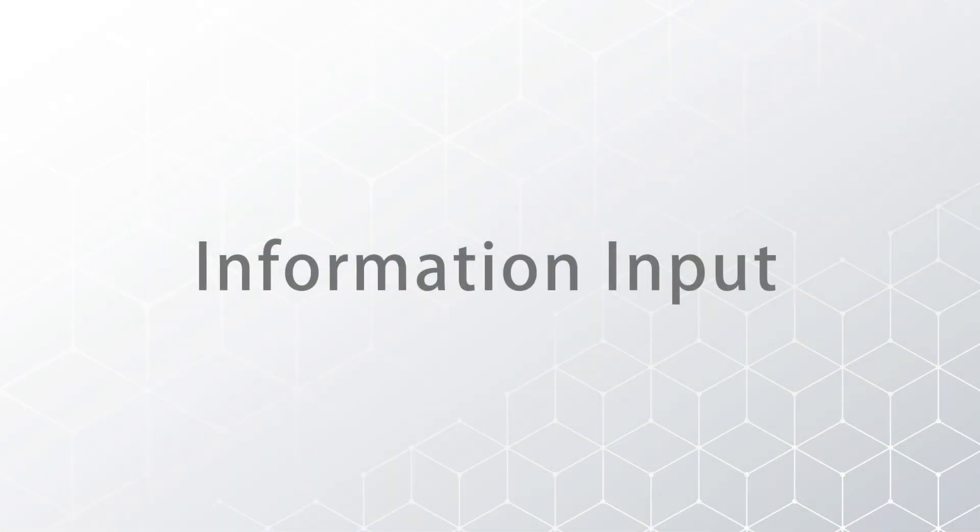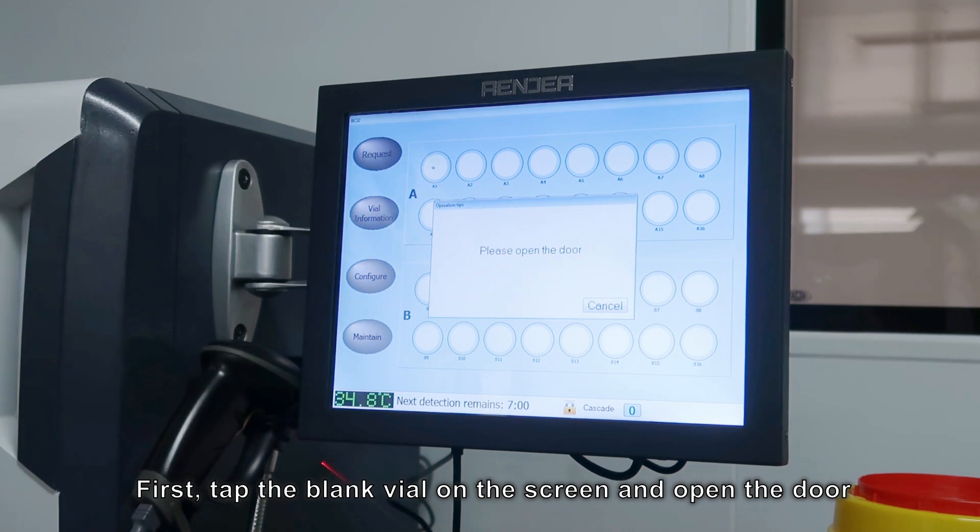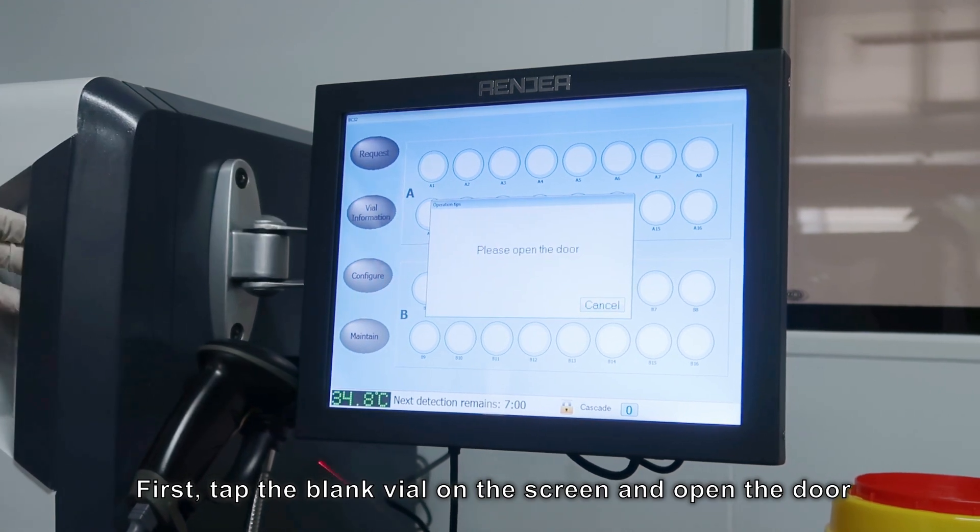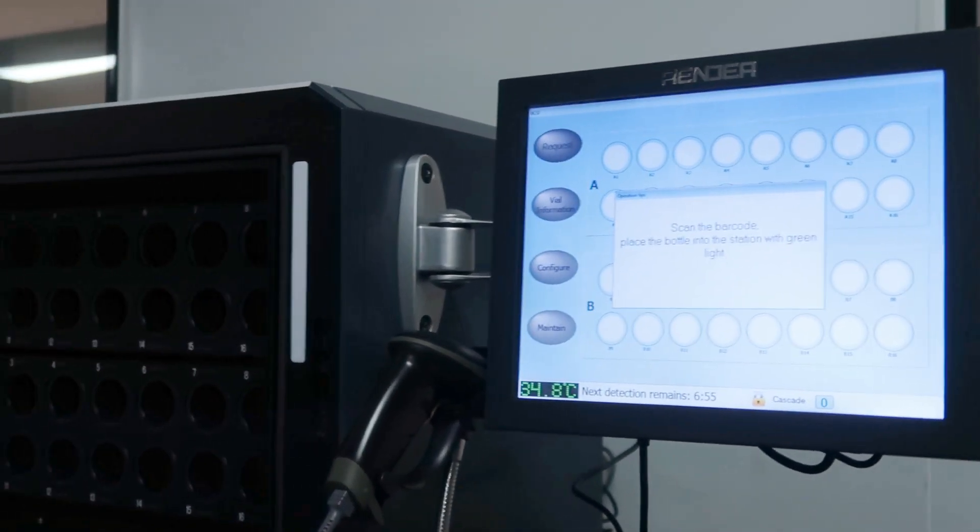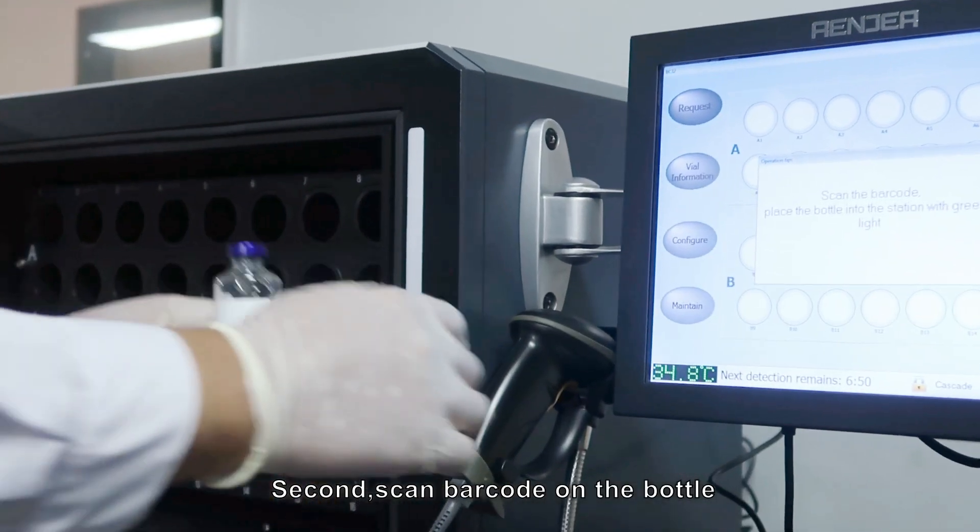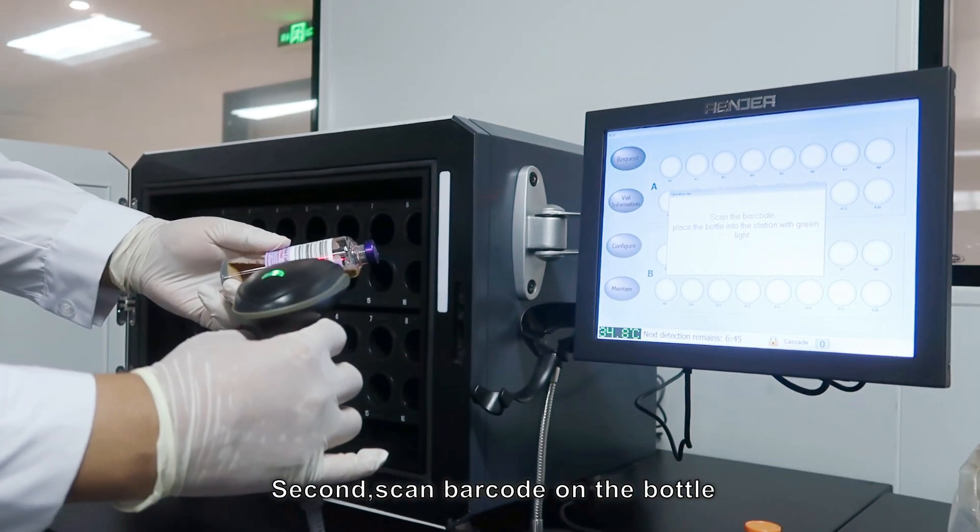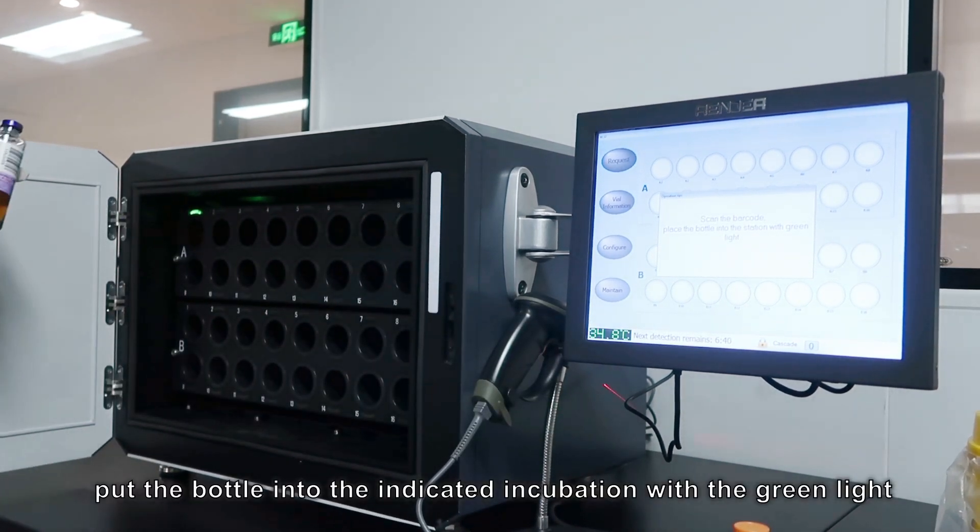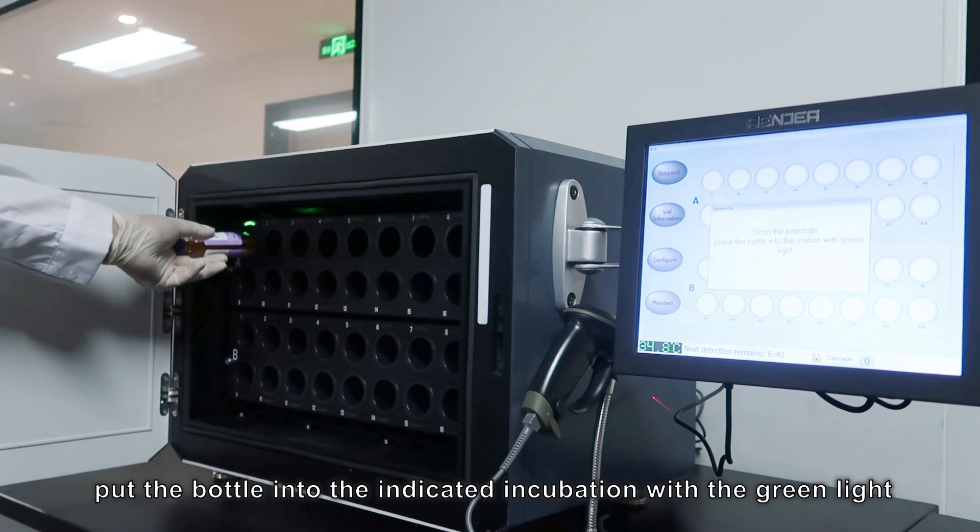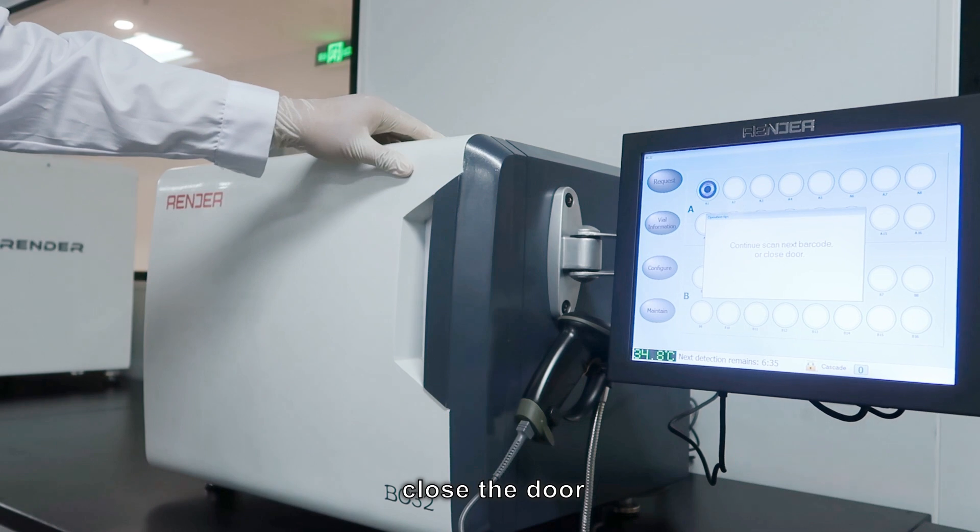Second, information input. First, click the blank area on the screen and open the door. Second, scan barcode on the bottle. Put the bottle into the indicated incubation chamber with the green light. Close the door.